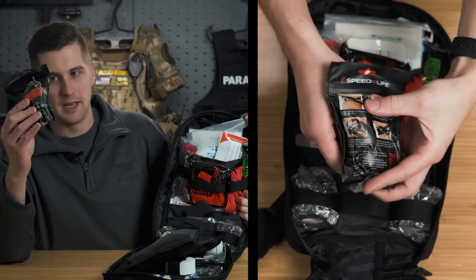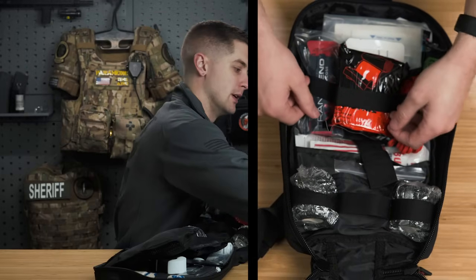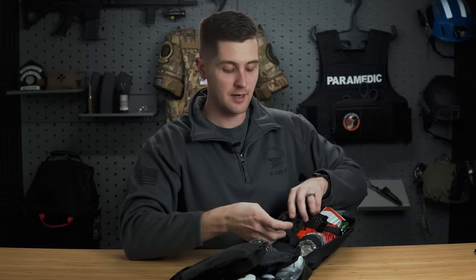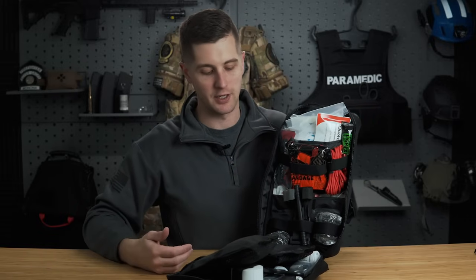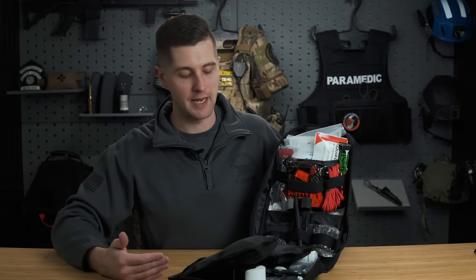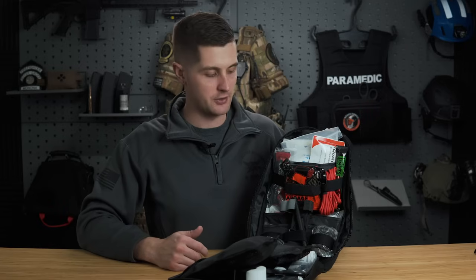So this, honestly, I'm going to throw it out and we're just going to fix it by putting in a CAT tourniquet. Fits in the same place and it's actually a viable option as a tourniquet. Honestly, I would keep tourniquets on the outside of the kit if you can, just because it's easier to access. That's a need-it-now item as opposed to something that I want to dig for. So you can fix that by throwing in a CAT tourniquet.